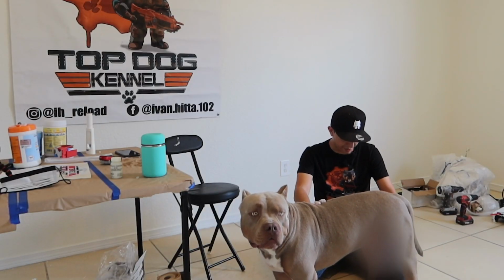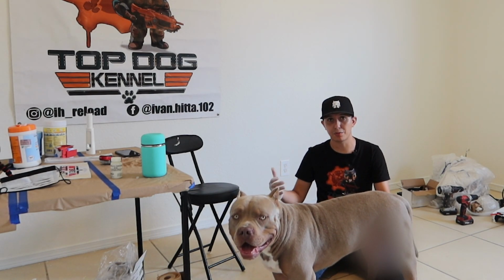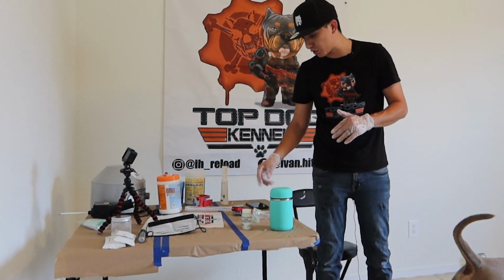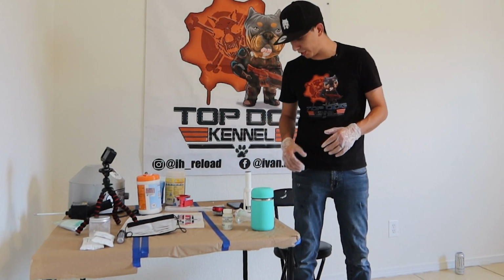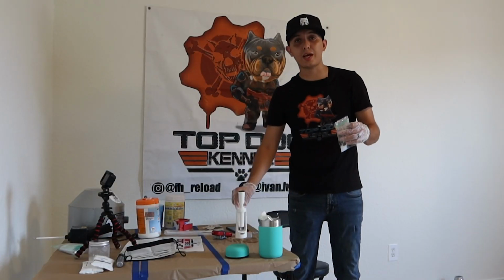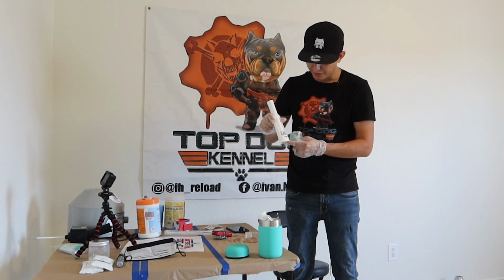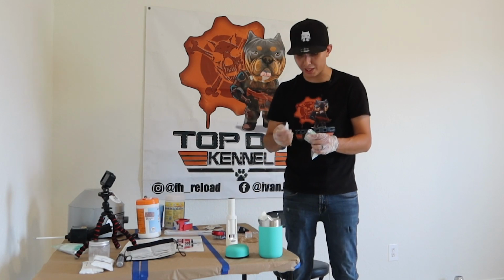All right, so yeah, after you're done collecting, what you wanna do next is check it under the microscope. So now what we're gonna do is analyze the sperm and make sure that it is sufficient and that it's alive and well for us to have a successful breeding. So let me go ahead and just get that collected. This next step, we do need a microscope to make sure that the sperm is alive and well and is moving like we need it to move.